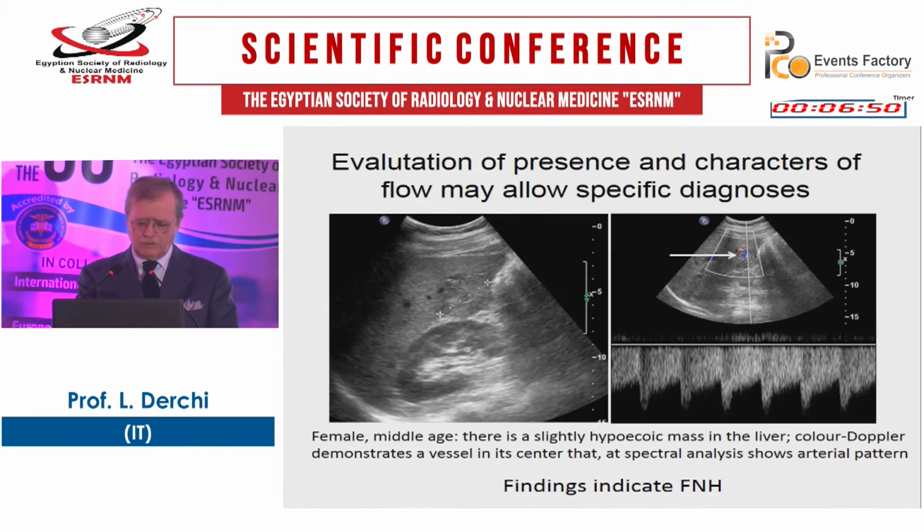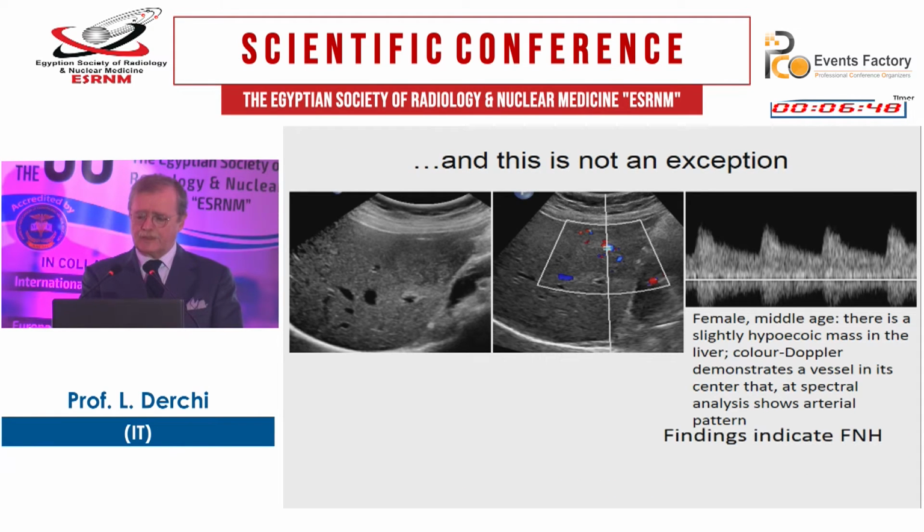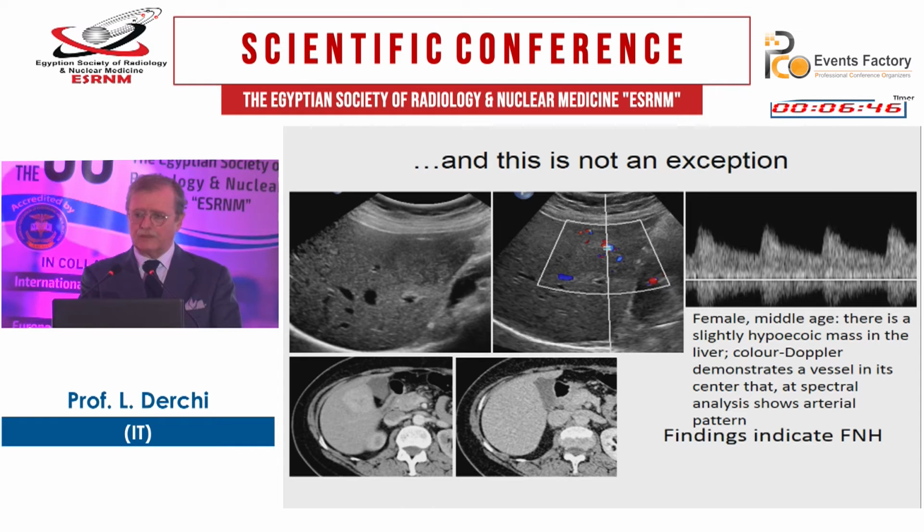Findings indicated focal nodular hyperplasia. She wanted to make a CT, and this again, findings confirm focal nodular hyperplasia. But it was so easy and simple to make it with ultrasound.